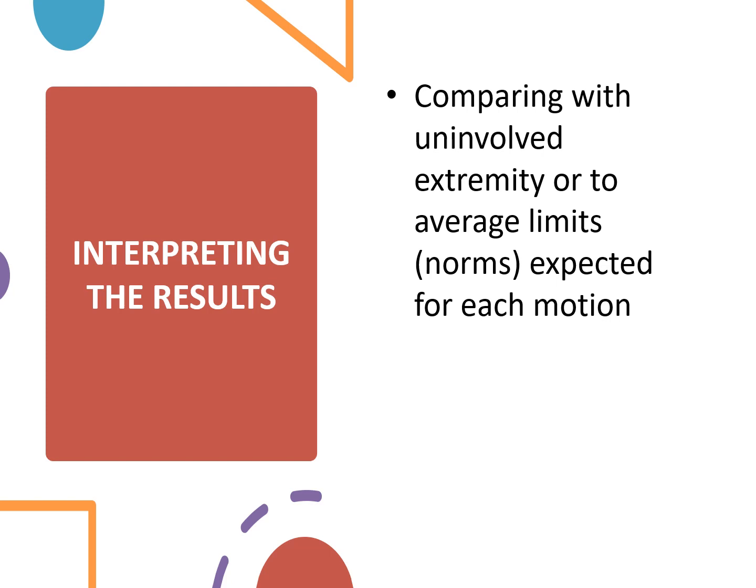Yes, there are normative values available. For example, 180 degrees of abduction, 180 degrees of flexion. But every patient is different. Sometimes some patients have a normal of only 160 or 170 degrees of range of motion. If that is normal for the patient, then the normative data changes. So you need to compare with the normal side of the patient. So if I have a problem at the right side, you need to first check my left side, all the range of motion, and then you come to my right side and assess it. Finally, you compare both the results. So that is how we interpret the results.